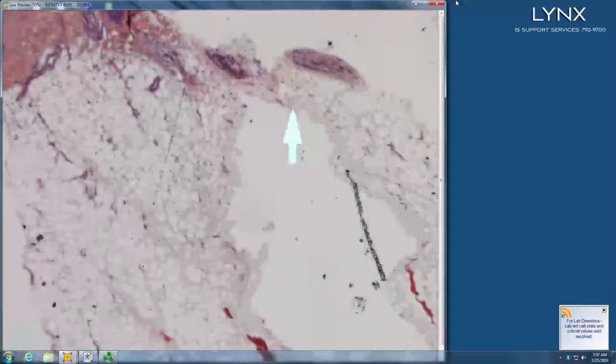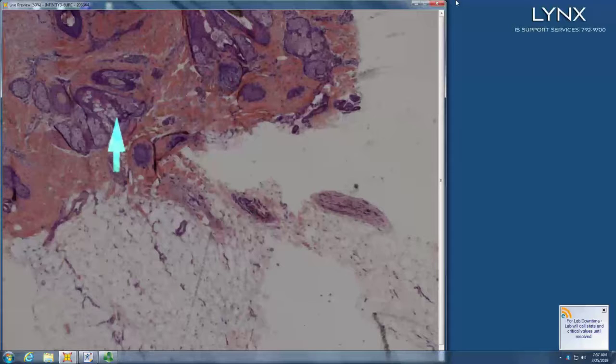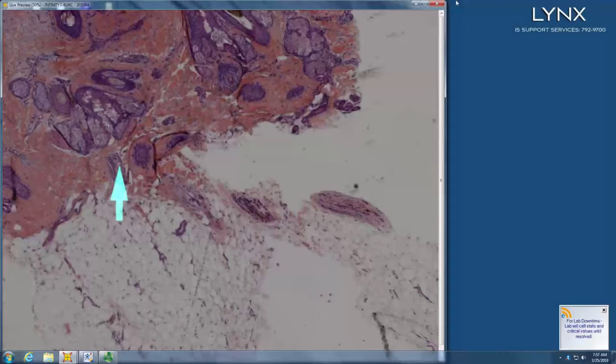Maybe an FFA. LPP. Yeah, but your sebaceous glands are intact. Yeah, that's right. So sebaceous glands intact, catagen hair, fibrous tracts with pigment, alopecia areata. Absolutely. Well done.